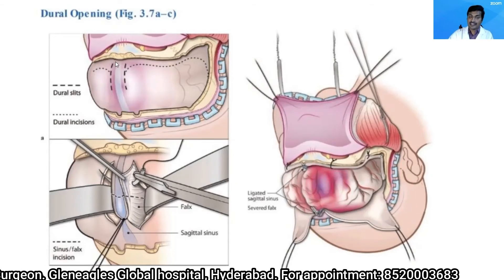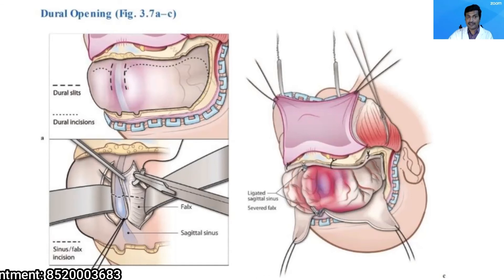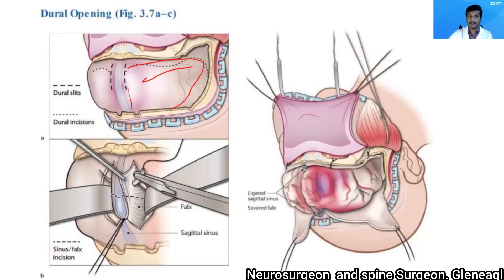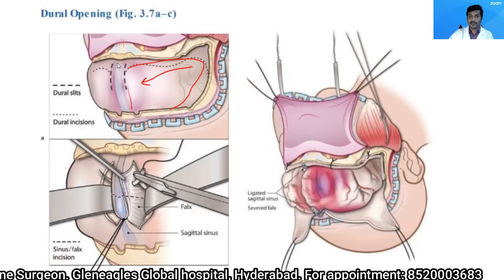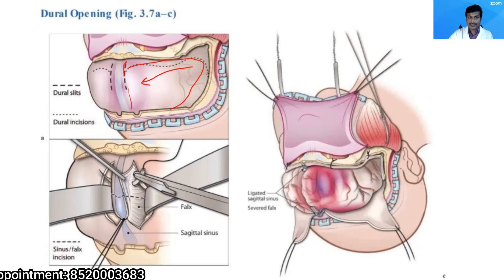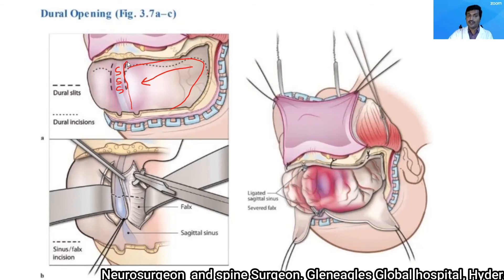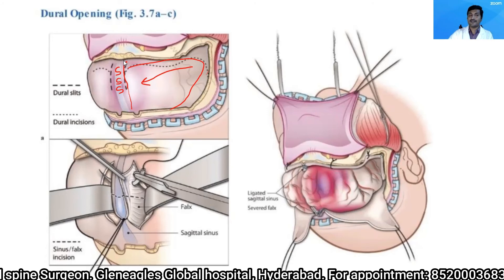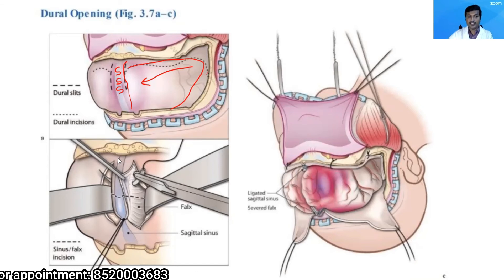Now open the dura mater. If there is no intention to cut the superior sagittal sinus, open dural flaps on either side with the base on the midline. However, cutting and releasing the superior sagittal sinus anteriorly will decompress the frontal lobe. To do this, take dural slits on either side of the superior sagittal sinus, as low as possible near the crista galli.